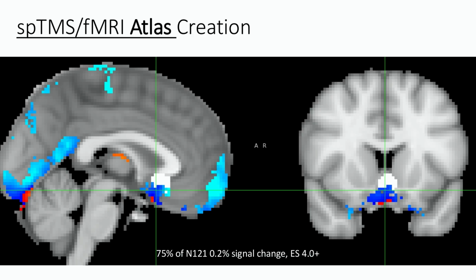This is another thing that I'm working on, which is just to put something out into the community, saying, all right, so we've collected a lot of data over the years with a bunch of different projects, and instead of saying that we know where the subgenual cingulate is, what we maybe want to optimize is the engagement of the subgenual in response to a TMS pulse. Right? And so if you look at the imaging response to the pings, the definition of where the subgenual cingulate lights up, in our case gives a negative BOLD response, and doesn't follow a sphere or even the FreeSurfer parcellation.